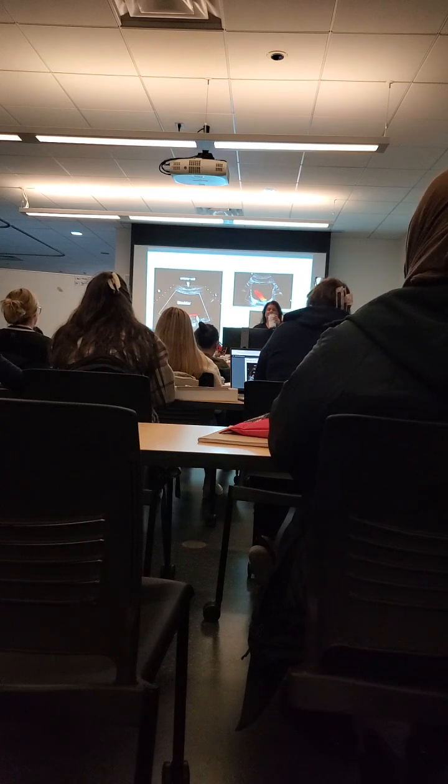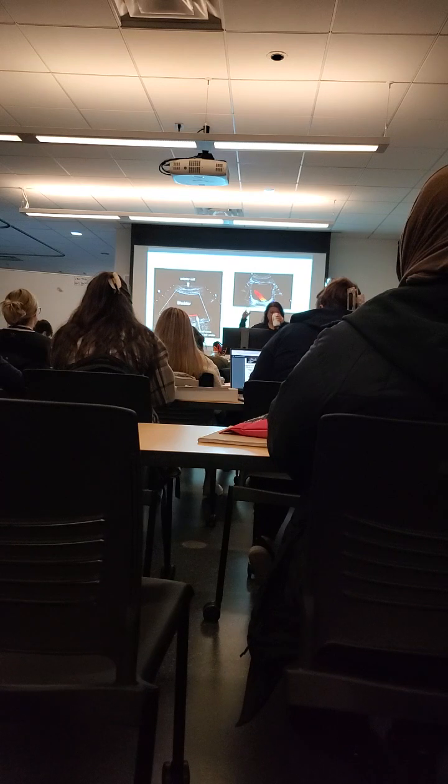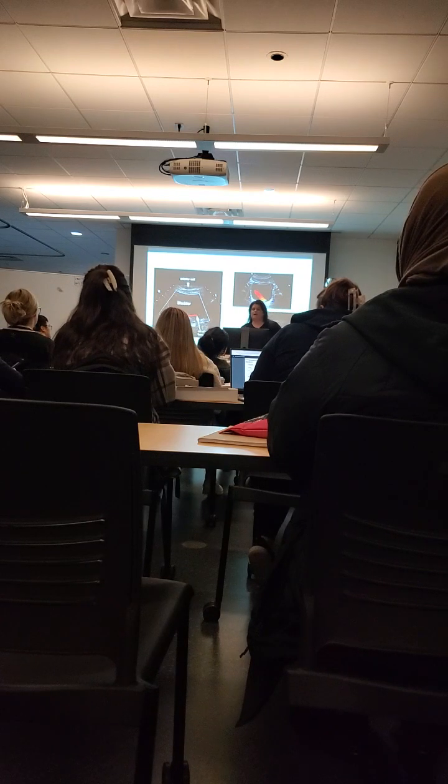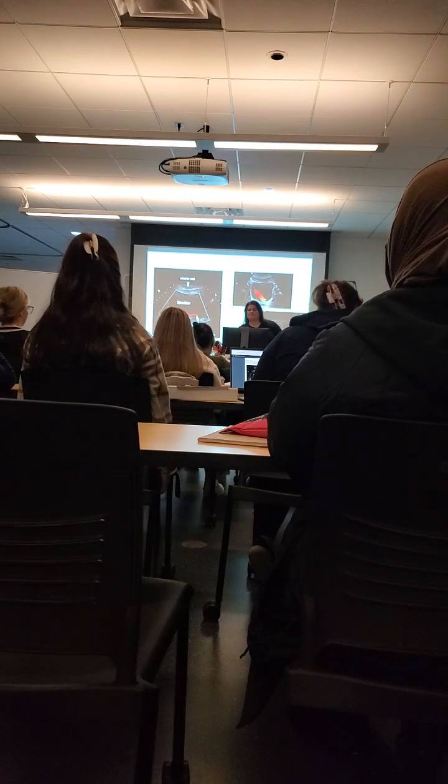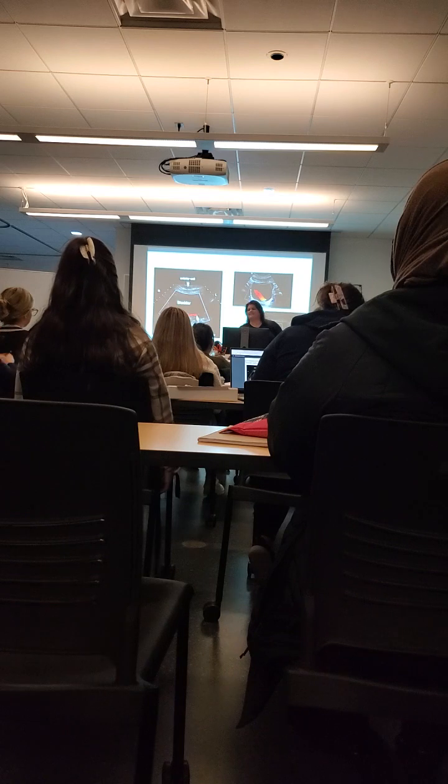Yes, dear? Why is that the left and not the right? Remember, if I'm transverse midline, breathe, we're midline. So is that transverse or sagittal? Transverse. You only get these in transverse, otherwise you won't really get them. But we're midline. So we know that this is right, we know that this is left. And since this is going this way, we know it's left. If it was going this way, then we know it's coming from the right and pushing out.